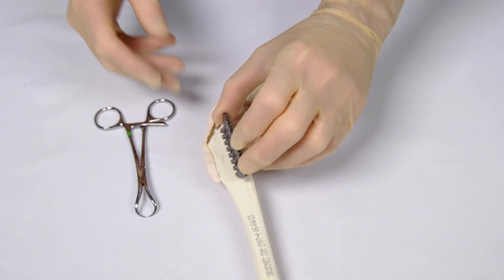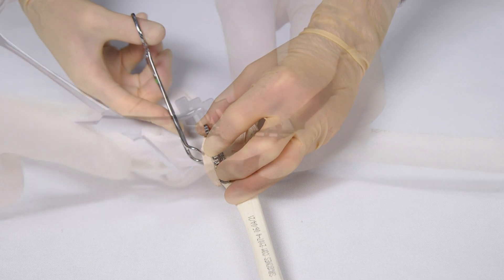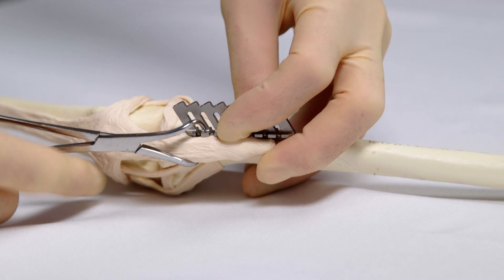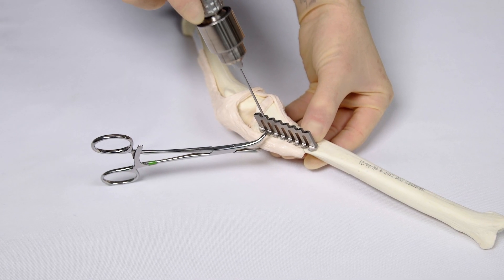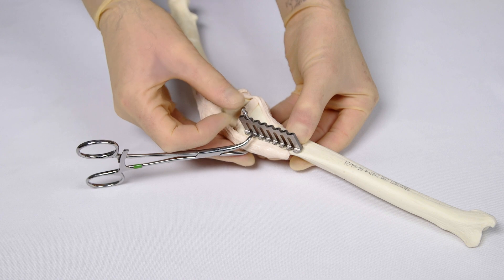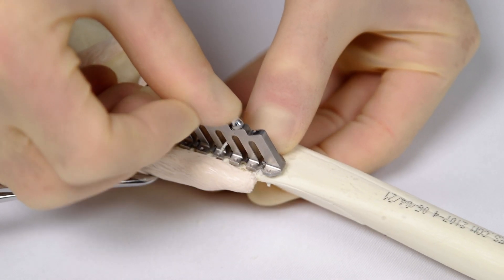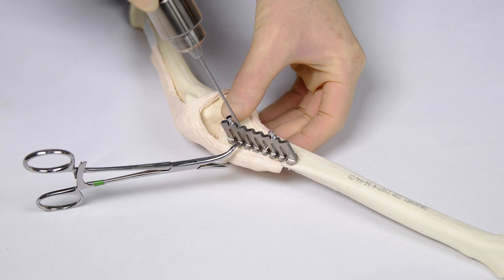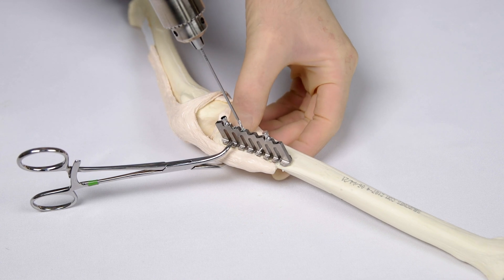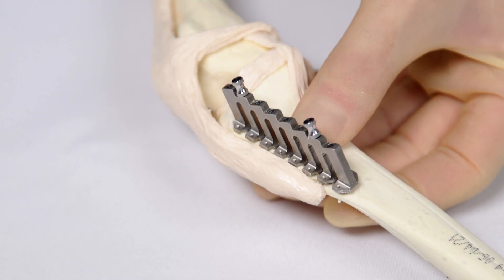The TTA drill guide is positioned over the tibial tuberosity with the holes pointing distally. The drill guide is secured to the bone using pointed bone-holding forceps. The most proximal plate hole is drilled and an anchor peg placed to secure the drill guide. The same is done at the most distal plate hole. The remaining holes are then drilled according to the plate size selected — so a five-hole plate has five holes drilled. The drill guide is removed from the bone.